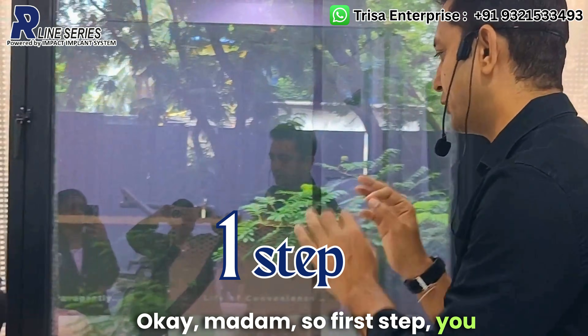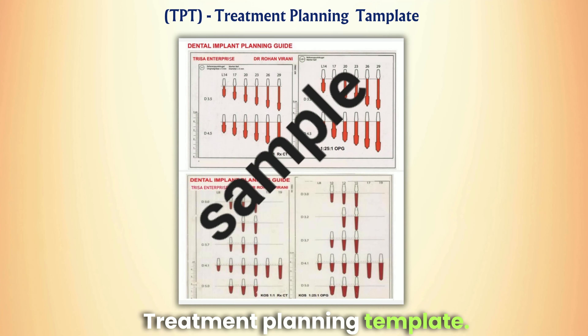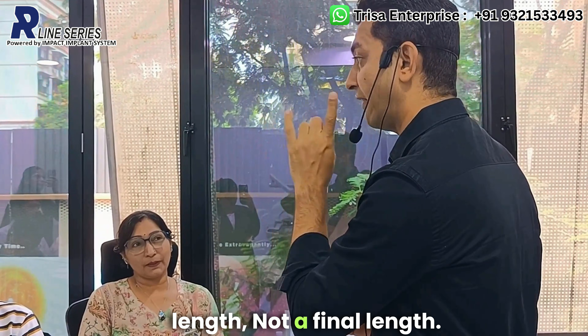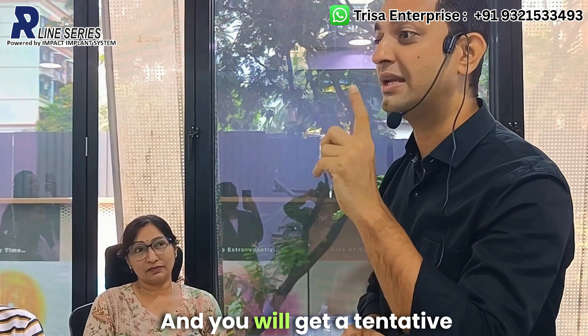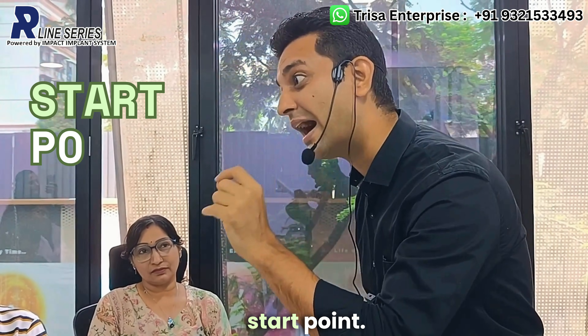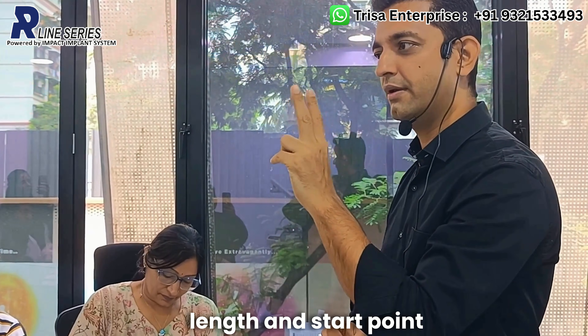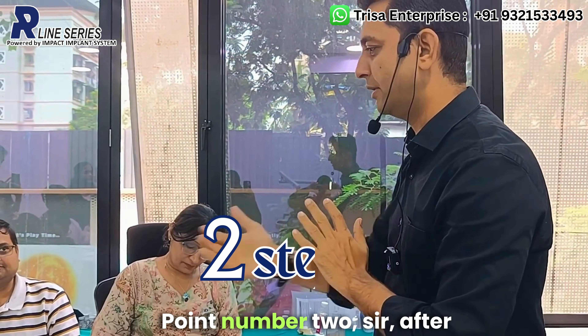The first step when planning for a pterygoid implant is the treatment planning template. With that, you will get a tentative length — not a final length — and a tentative start point. Length and start point for your pterygoid implant are very important outcomes from this step.